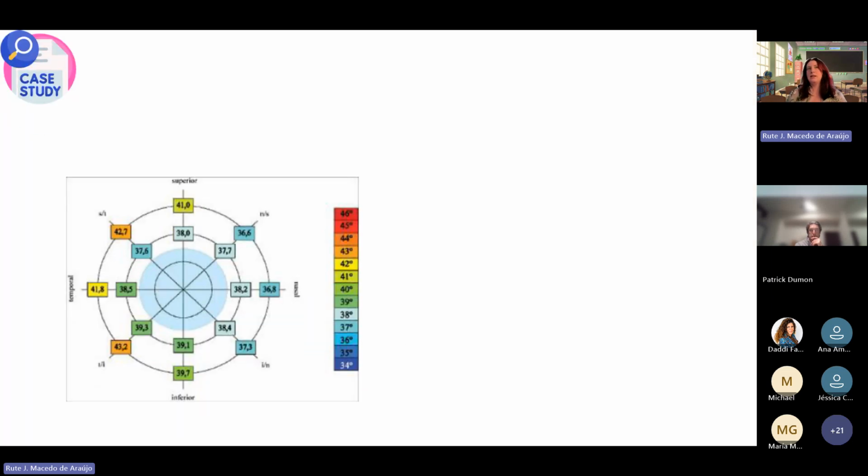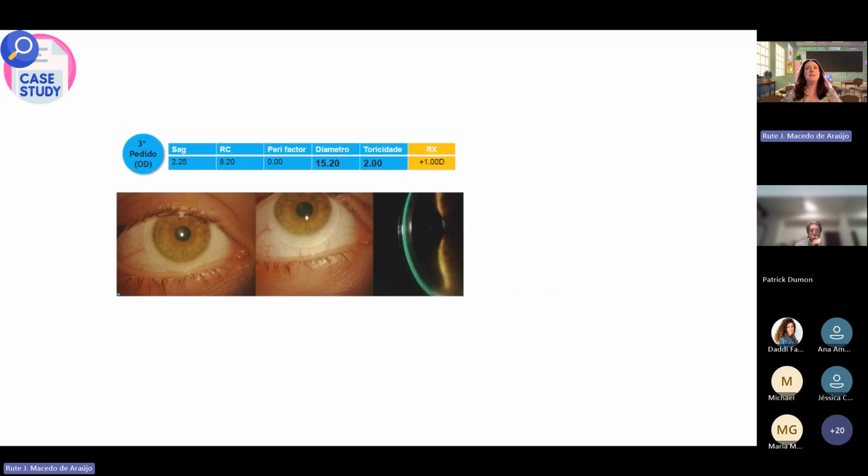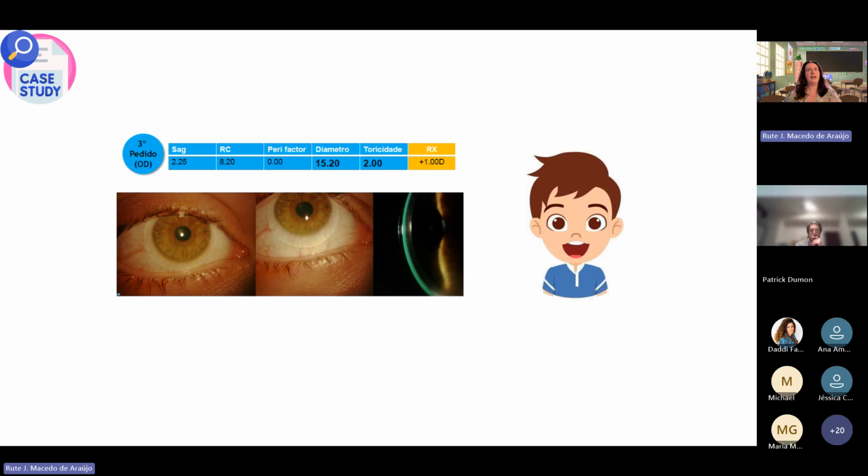So we know that the scleral lens is asymmetric, and that asymmetry is higher as we move away from the limbus. So let's try to decrease the diameter of this lens. Probably the toricity of the sclera of this patient will not be that high near the limbus. So I decreased the diameter, decreased the toricity, and decreased the sagittal height of the lens. And that was perfect. We only needed another lens order to adjust the refraction, because only when we achieve a good fit is it possible to do a good over refraction.